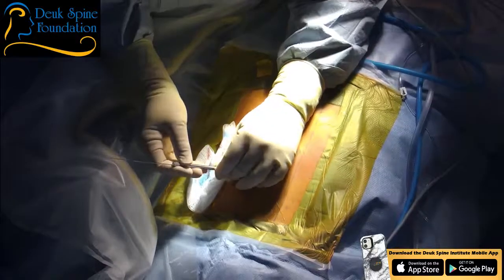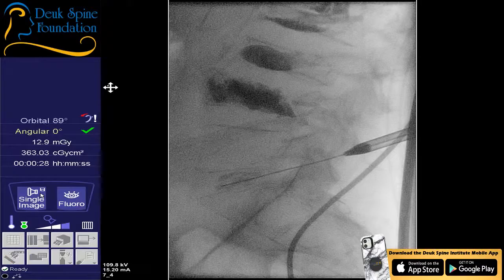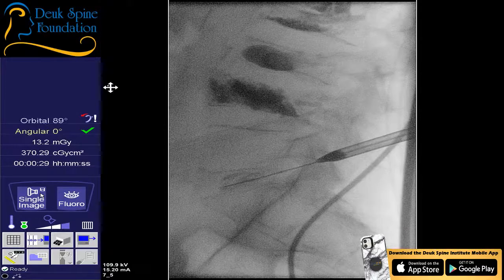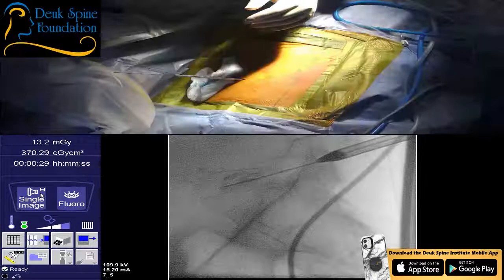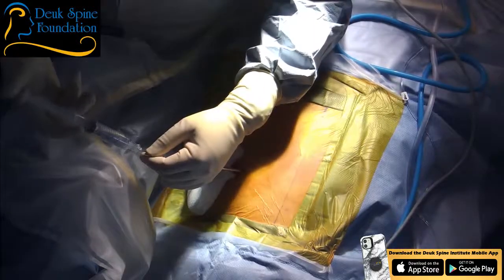We're making our way down to the foramen. Let me see where we are. I can give him a little more medicine right now, just a little bit. Put the needle on. I've injected another 2 cc's. And what is this, Luis?